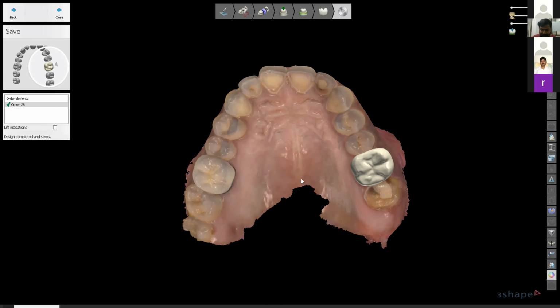Ma'am, I wanted to ask, this is customized software like Dr. Ashutosh's for the crown, but there are software like Geomagic in which free-form drawing can be done. So can we design a crown in that?